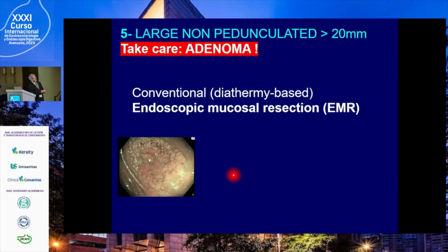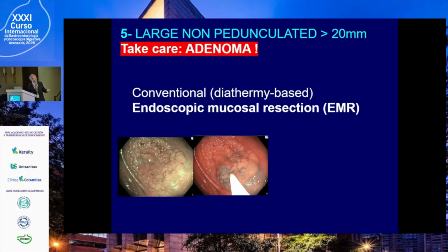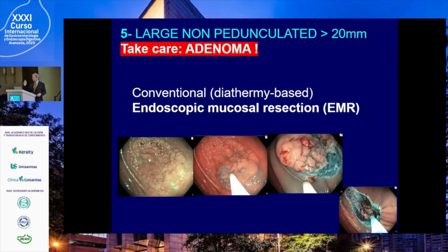And in case of adenoma, okay. This is from ESGE. We can perform endoscopic mucosal resection, such as this case, because this was homogeneous, such as your case, homogeneous lateral spreading tumor, okay, homogeneous. Okay, so it was possible to do this.